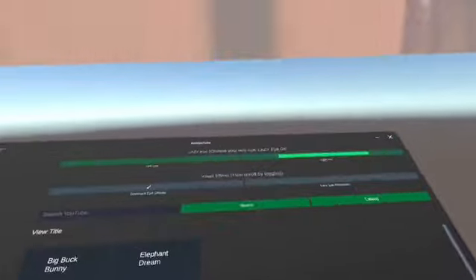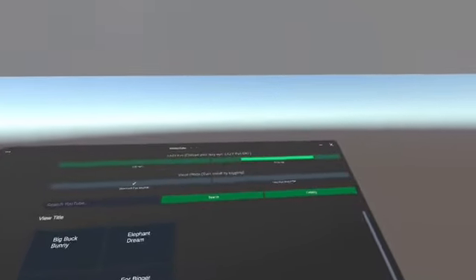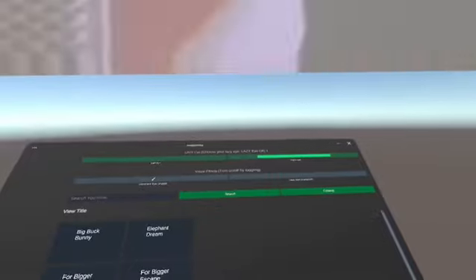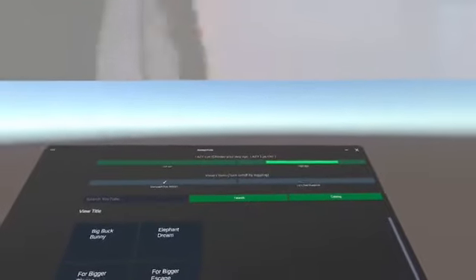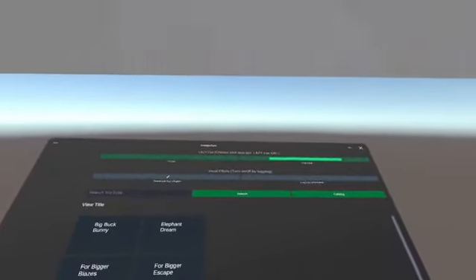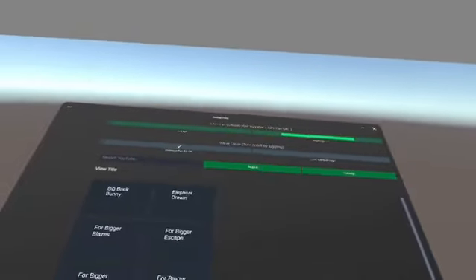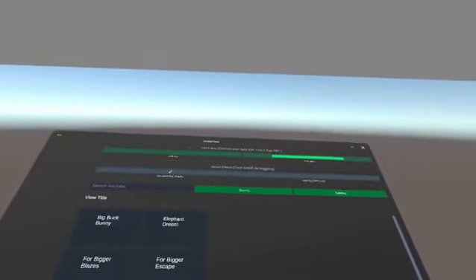So today I will be telling you about amblyopia, okay, Amblotube. People who have lazy eye syndrome or amblyopia tend to have an eye which is weaker, okay, and there are two techniques basically which can help them train their lazy eye. One is patching, and patching is the gold standard, okay. This is the most recommended therapy where you patch your dominant eye so that the neural pathways of your lazy eye become stronger and you can see from your lazy eye also, okay.